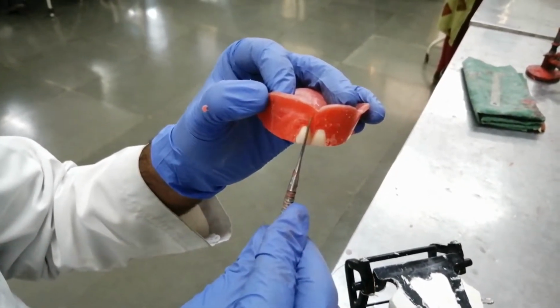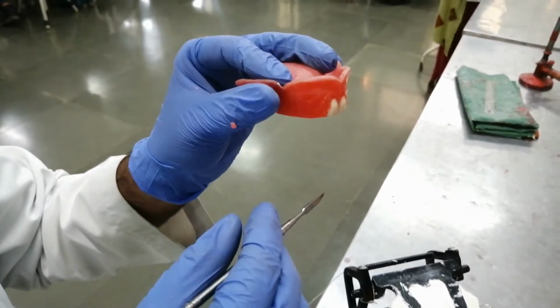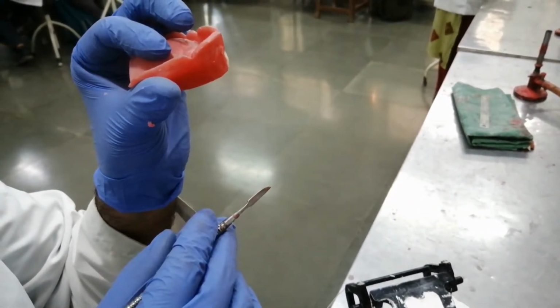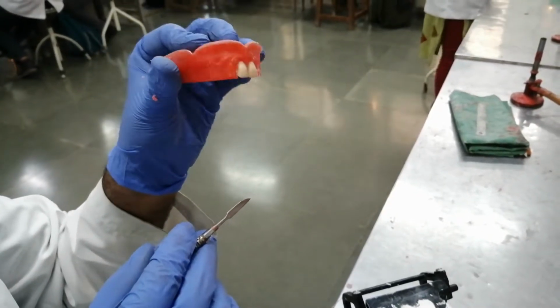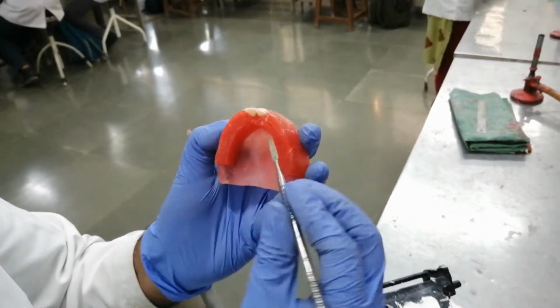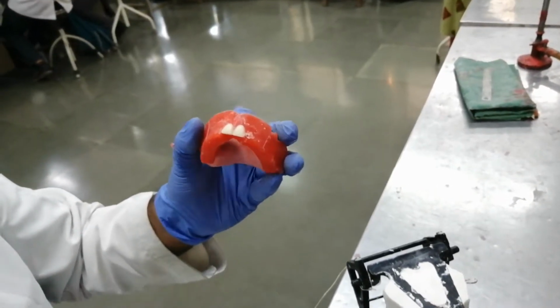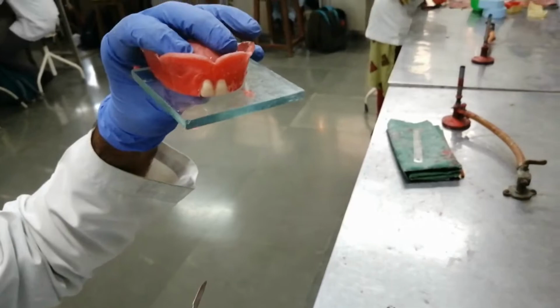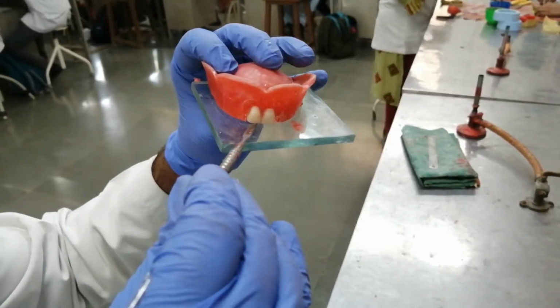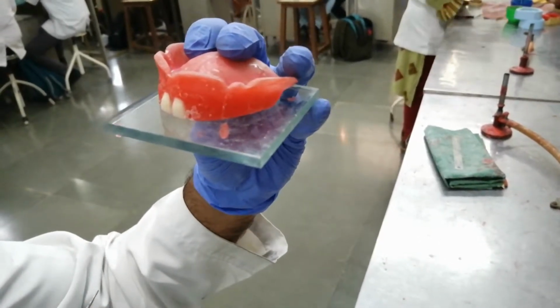You can see that the midline is secure, the long axes are secure. From the proximal view, the teeth are proclined. And according to the arch form, teeth alignment is secure. There should be no gap between occlusal rim and the glass plate, and entire incisal edges should touch the glass slab.